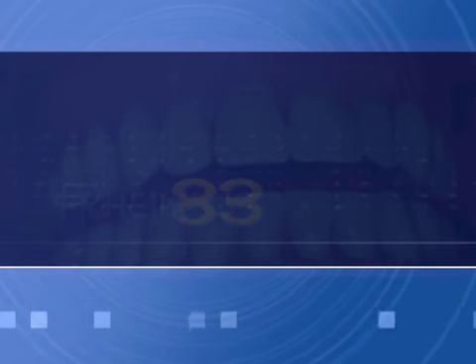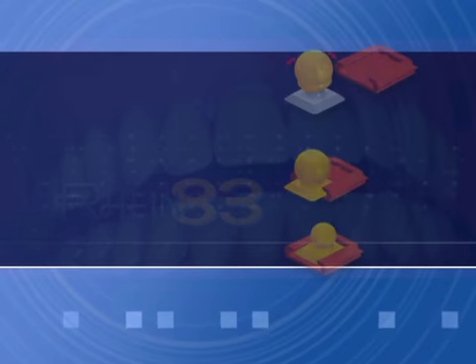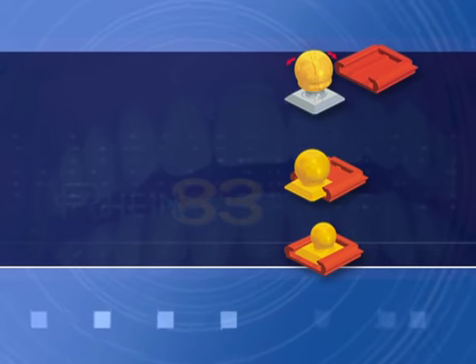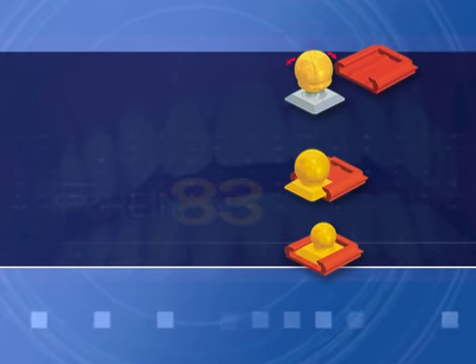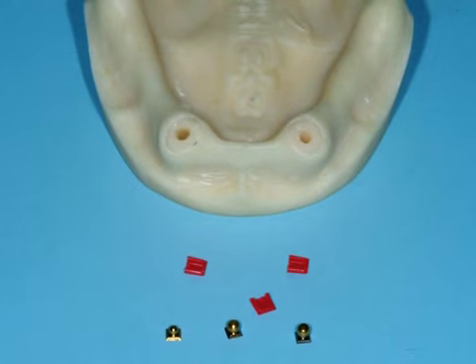Over denture roots — cast posts with prefabricated titanium single sphere, inserted and glued. These single titanium spheres, extra coated with tin, can be cemented to the sliding base with retentive undercut. If preferred, they can also be laser welded.